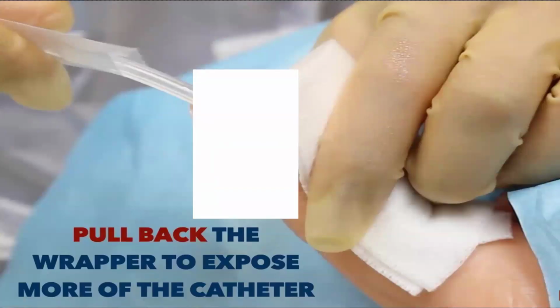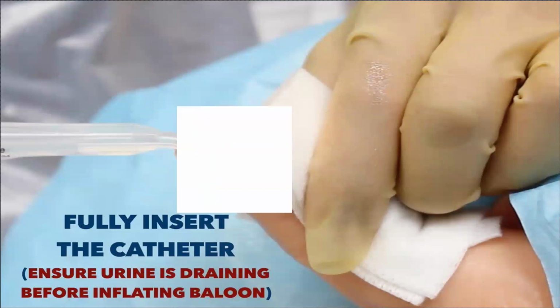Usually, sometimes they could feel a bit of discomfort, but it shouldn't be painful. And if at any point you encounter any obstruction, you should abandon the procedure and ask for help, usually again from a urologist. So once you've put in the catheter up till the flange, that's the end. And the next thing would be to inflate the balloon. At this point, you should already see some urine coming out, especially if the patient is in retention.